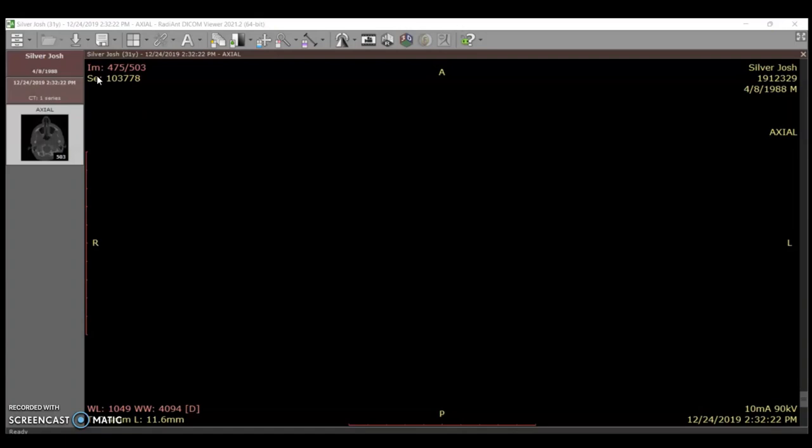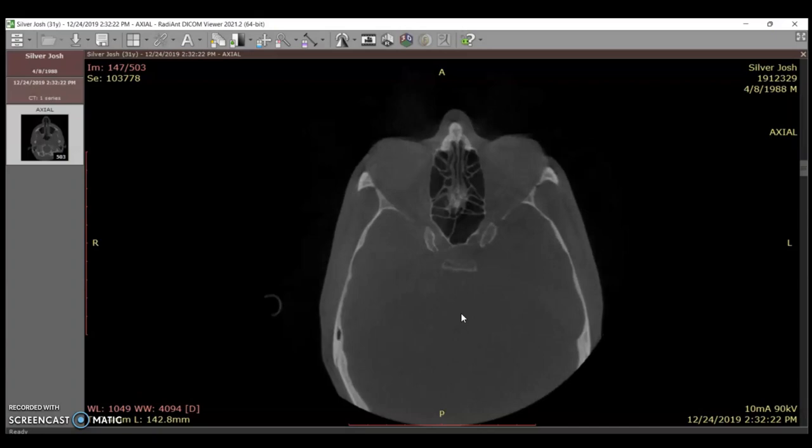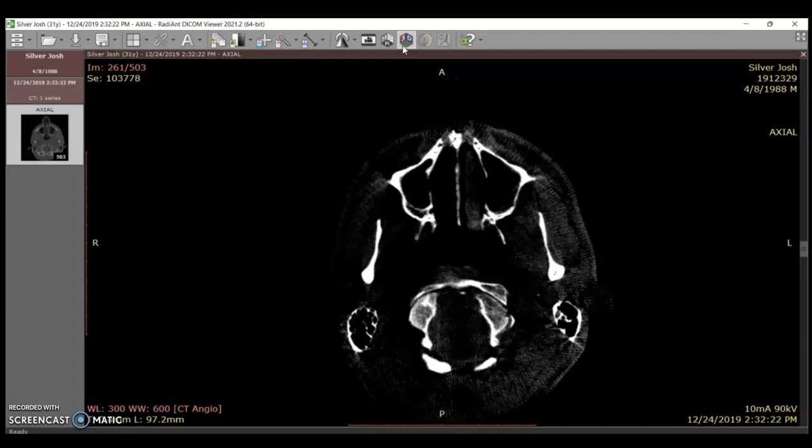We are going to go through a cone beam analysis of this fine specimen. His name is Josh Silver — oh, that's me. Okay, let's take a look. Here's our regular viewer.